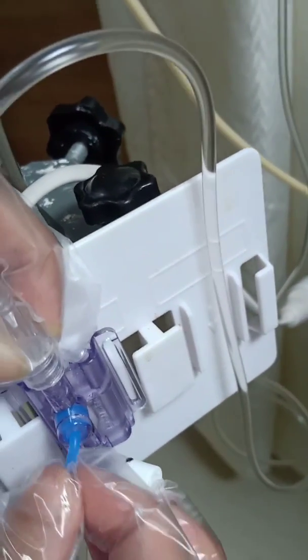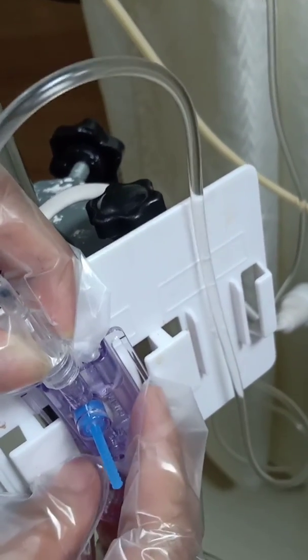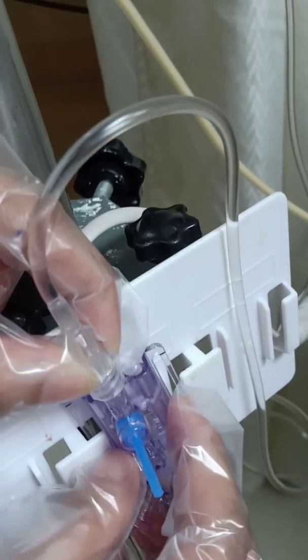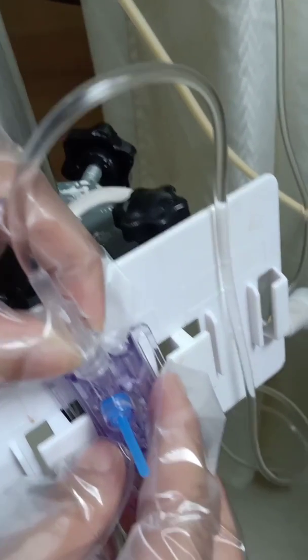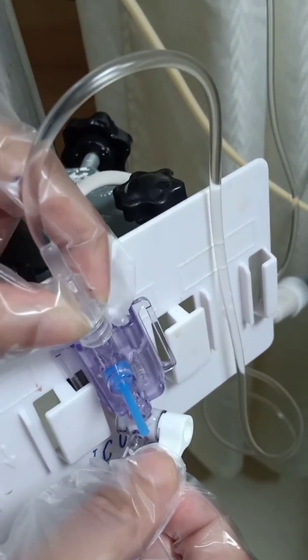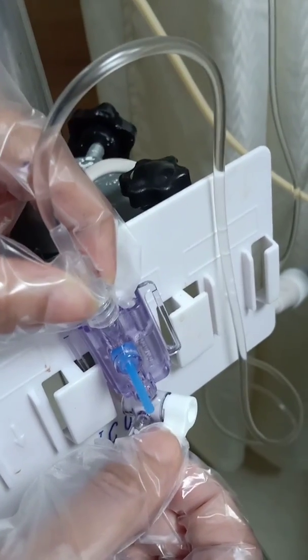This transducer should be at the level of the heart — what we call the phlebostatic axis — which roughly corresponds to the right atrium. When placing and zeroing it, it should be kept at this level, and whenever we change the position of the patient it is desirable that you zero the system again.